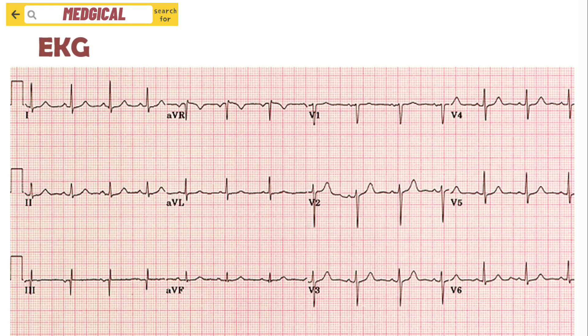Please pay attention that in Lead 1, we can see the R wave is upward, similar in V6. In AVR, the R wave is downward. In V3, it is slightly upward and slightly downward. The reason for this is because of the direction of the leads, which will be explained in the next several slides.